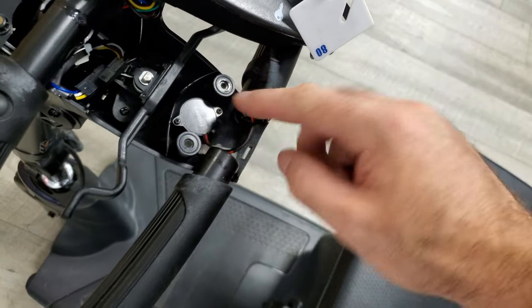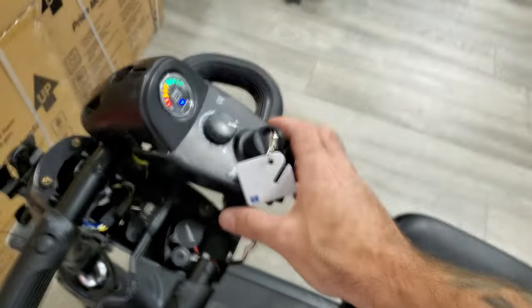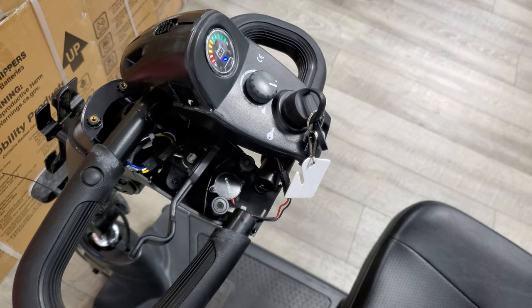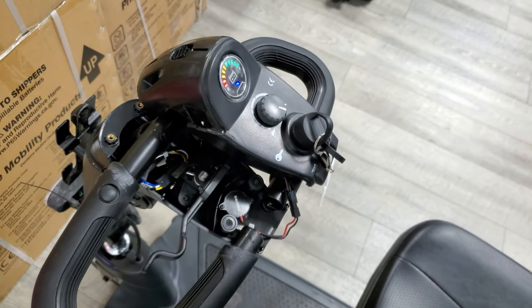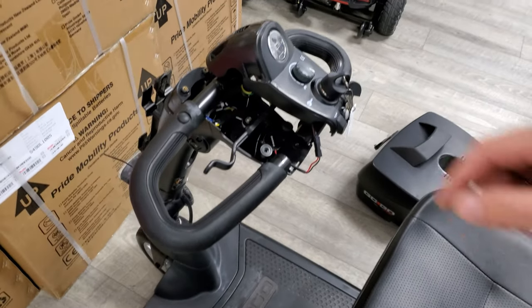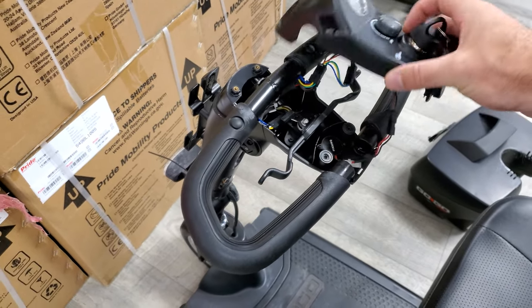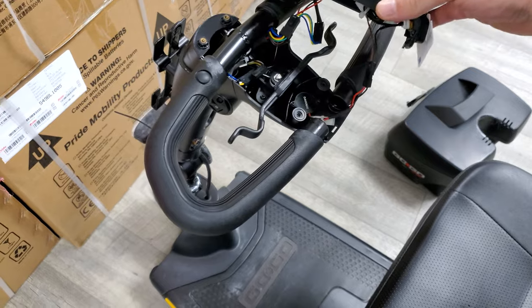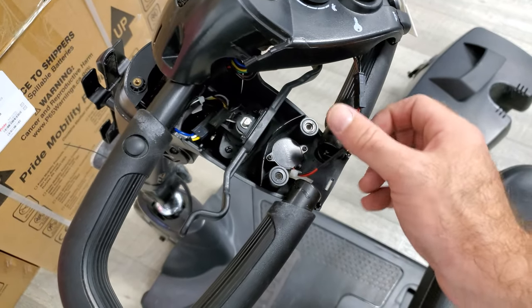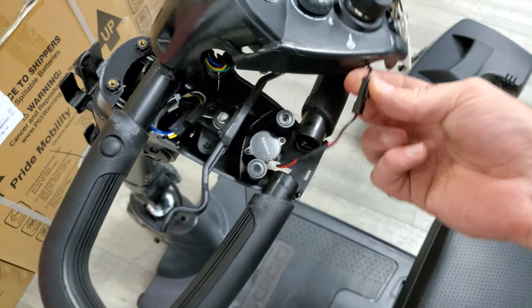What we have here is the console — it comes off, and right here is your horn, so it's connected. We first want to make sure that the power is off and disconnect the battery before doing any electrical work. Now that I've turned off the scooter and taken the battery out, it's safe to work on the unit. What we're going to need to do is disconnect this wire harness here.